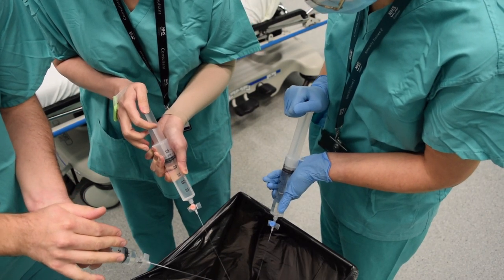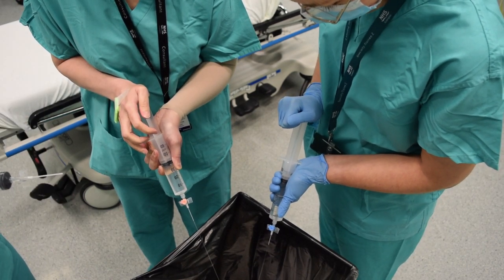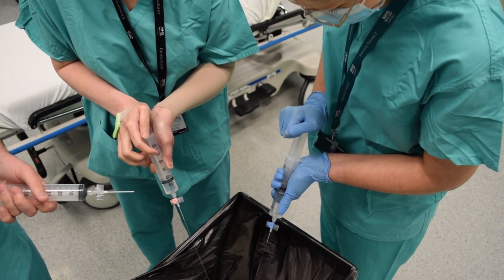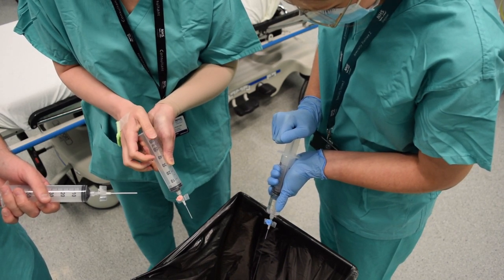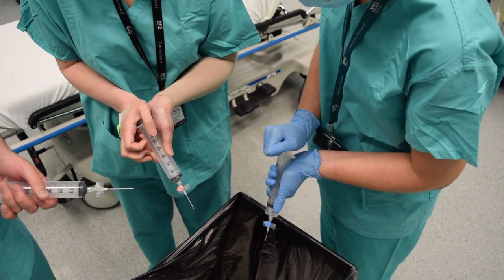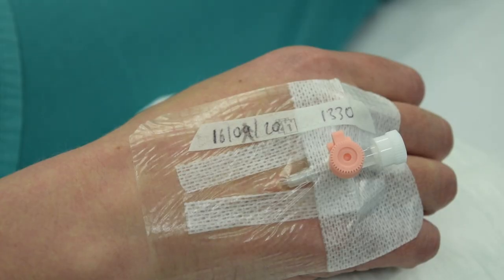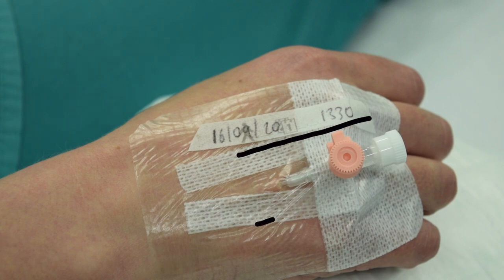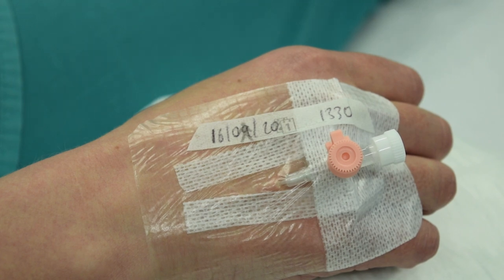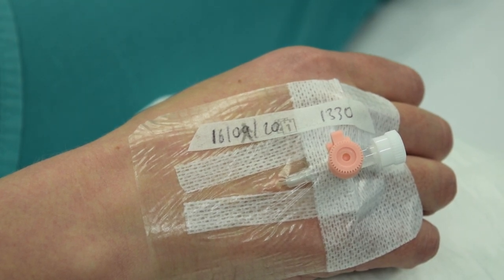In an emergency, access to a big vein for a big cannula is the most important thing — there are very few situations where a blue or even pink cannula belongs in the antecubital fossa. Big drips go in big veins; small drips go in smaller veins. Try to save the large antecubital veins for resuscitation. Make sure the Venflon is dressed appropriately with sterile strips across the wings, inserted up to the hilt, with the dressing covering the insertion site — all to reduce the likelihood of significant infection.